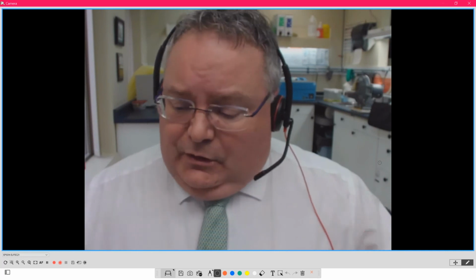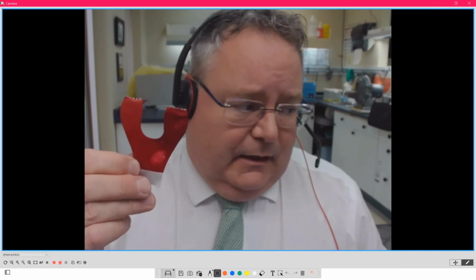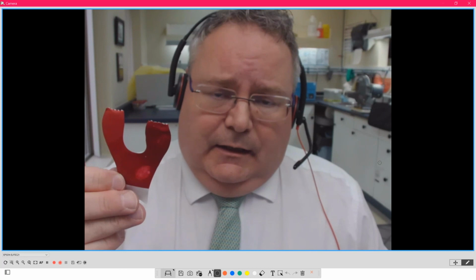And that freedom is good. So that's important. There's your wiggle. So it's important that we follow those things. And then I can calibrate it by, again, watching how I use articulating paper.